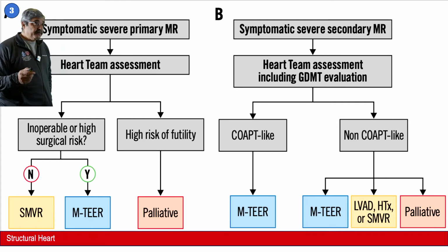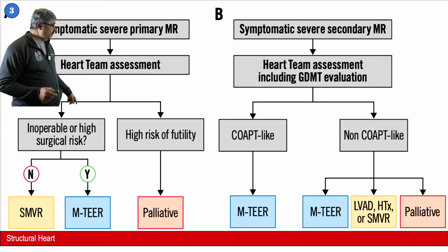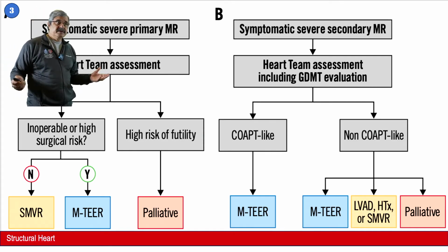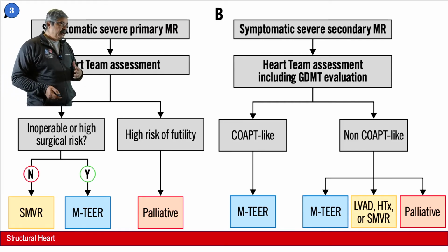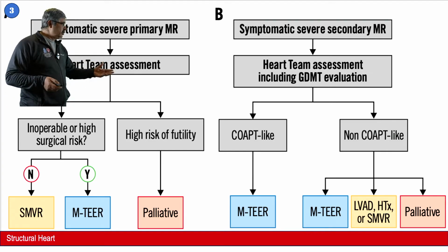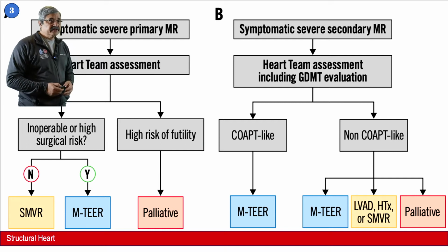So if you have symptomatic primary MR, that is, you have mitral regurgitation which is due to a structural abnormality of the valve, you are eligible for edge-to-edge repair only if you are inoperable or prohibitive risk for surgery. And if you have symptomatic severe secondary MR, which means you do not have any structural abnormality of the valve, and you are COAPT-like, which means you have disproportionate mitral regurgitation, then you are a great candidate for edge-to-edge therapy. And if you're non-COAPT-like, which means you have proportionate MR, then you have other options: LVAD, a heart transplant, or surgical mitral valve. So this is where we stand with these situations.